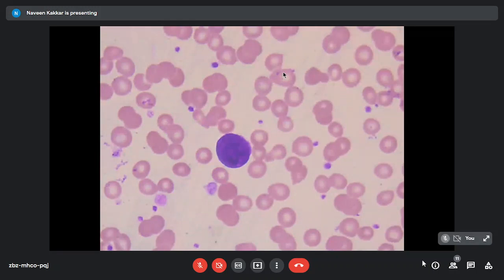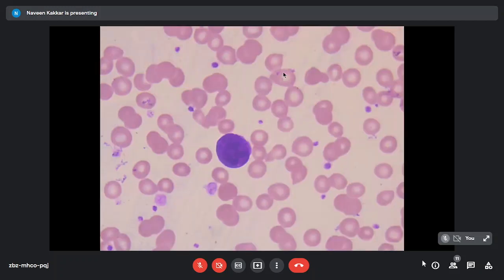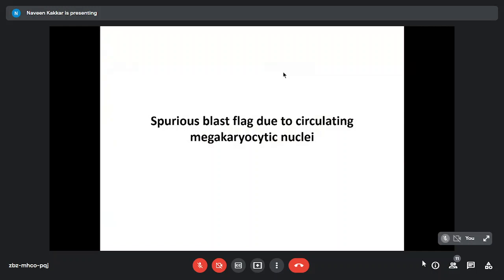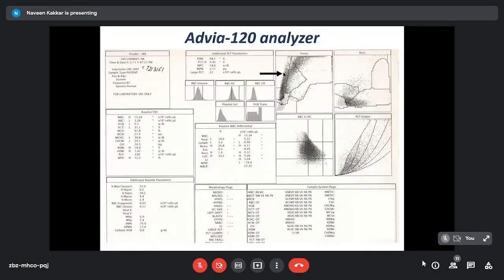So the thing to remember is they may have cytoplasm. Sometimes they may have cytoplasm, but very scanty, very high density of the nucleus, no nucleoli, and you can't place them in any white cell that you know of. So these are marrow elements coming out. So here the instrument is telling us probably blasts, but they were just these nuclei. And remember, these are MPO negative because there's no other material to stain. So they will be counted as unstained cells which do not take up the MPO stain.